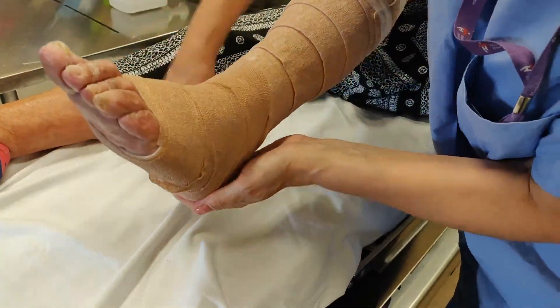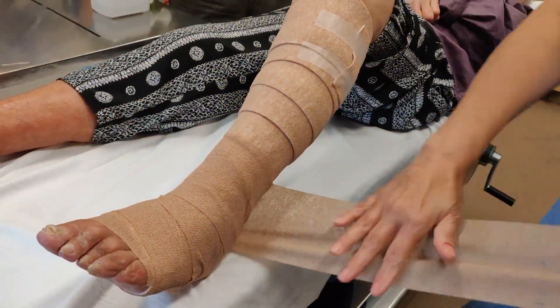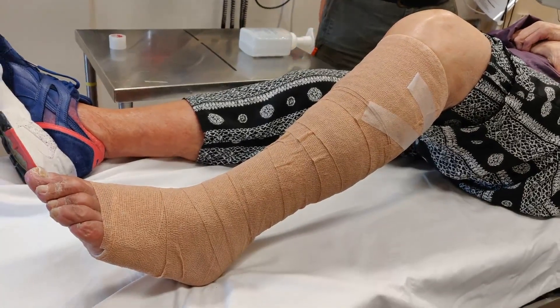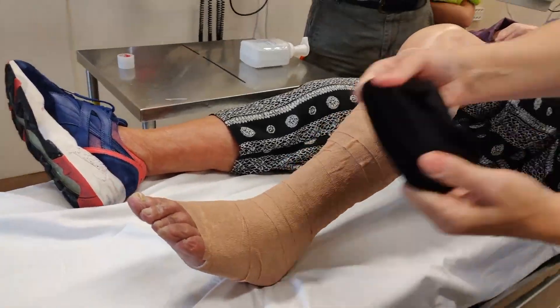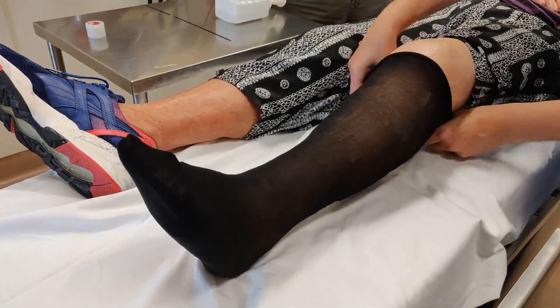It is important to note that an ankle brachial pressure index is conducted to ensure that there is sufficient blood pressure for an environment of healing. The patient will continue to have the wound redressed in the future. Compression socks will also be used in future treatment to recover the function of the veins.